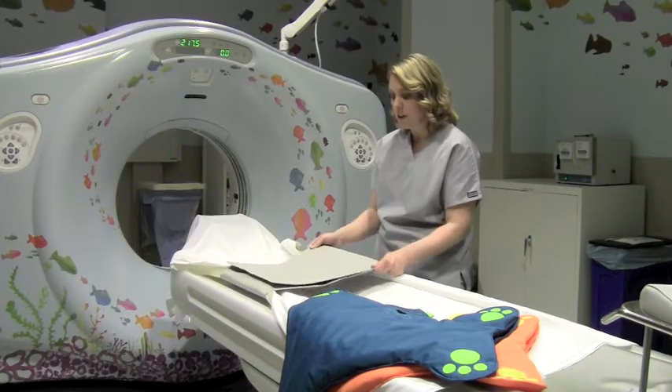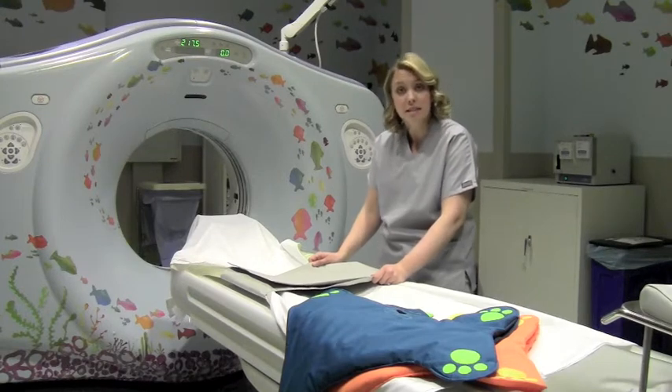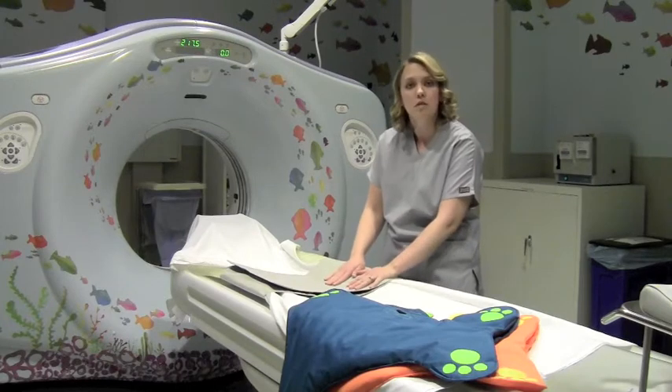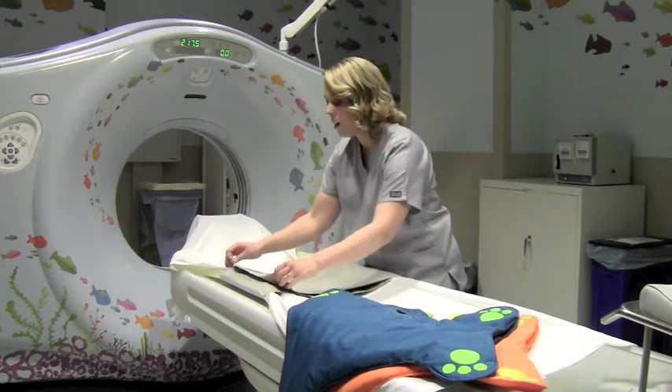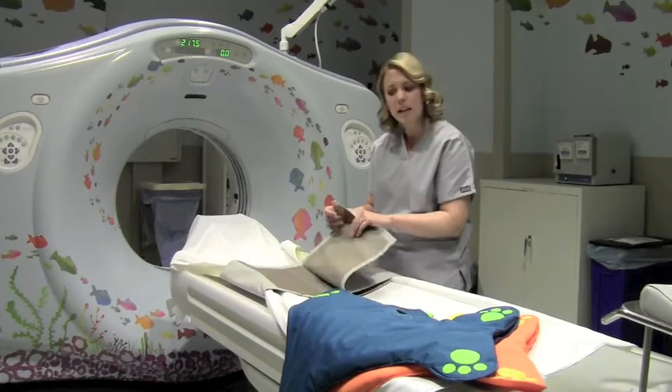This strap is very reminiscent of a seatbelt, and it can cause anxiety in children. Generally, they don't like to be held down, and so this doesn't feel like a safe choice for them. It also seems a little more cold and uninviting.